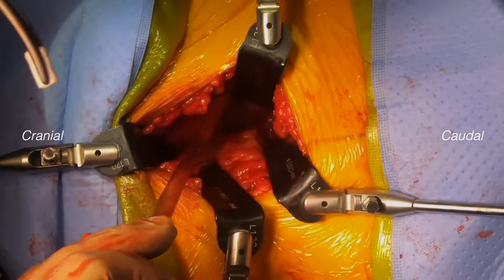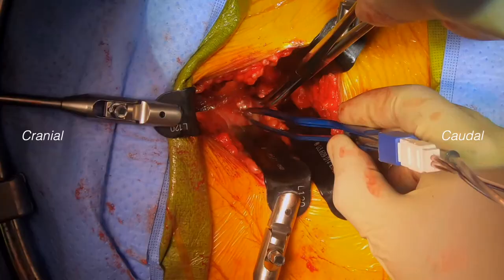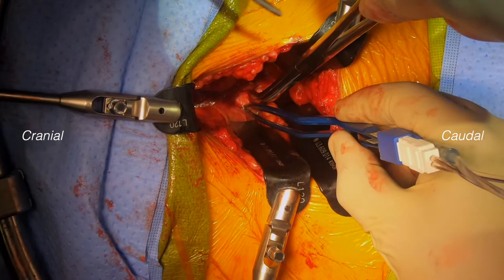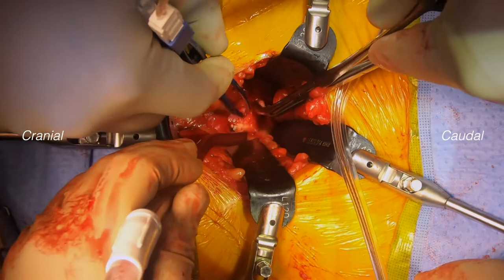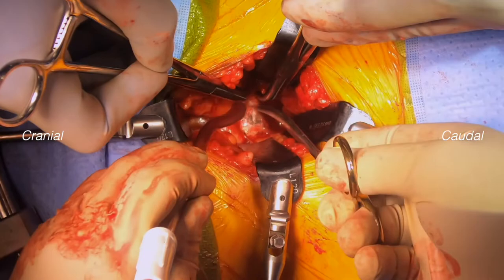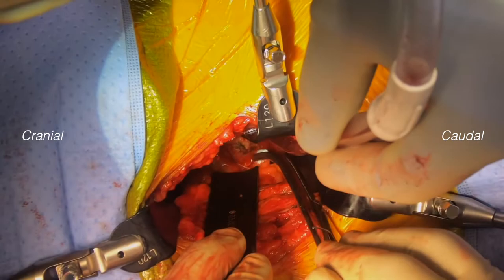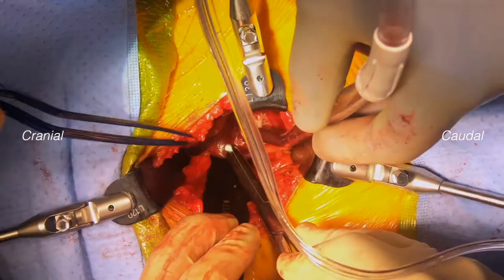We place retractors to visualize the sacral promontory and L5-S1 disc, as well as the left iliac vessels, which are then protected behind retractors. The anterior annulus of L5-S1 is seen here. The descending sacral vessels are cauterized, as well as other small bleeders, which are then incised prior to retraction so that they are not torn off the common iliac vein or artery.